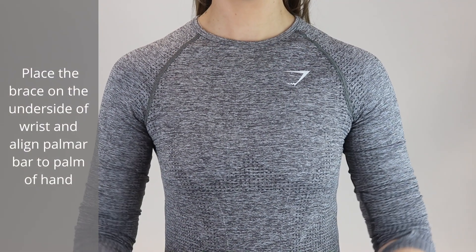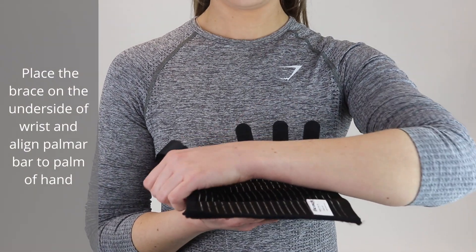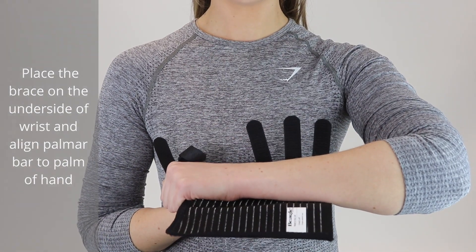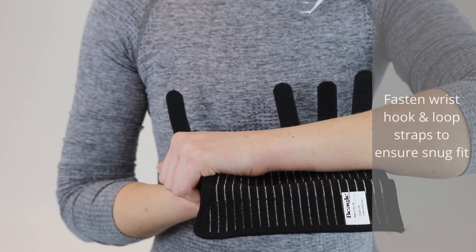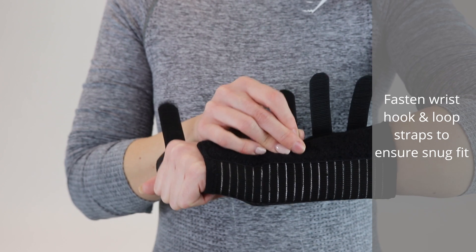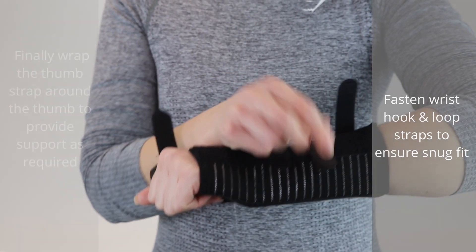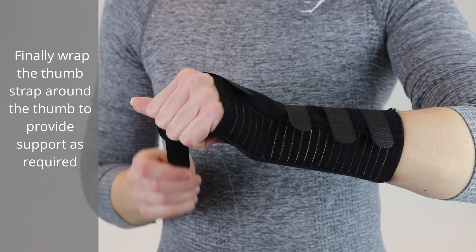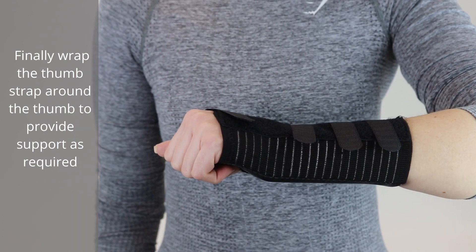Place the brace on the underside of the wrist and align the palmer bar to the palm of the hand. Fasten the hook and loop straps to ensure a snug fit. Finally, wrap the thumb strap around the thumb to provide support as required.